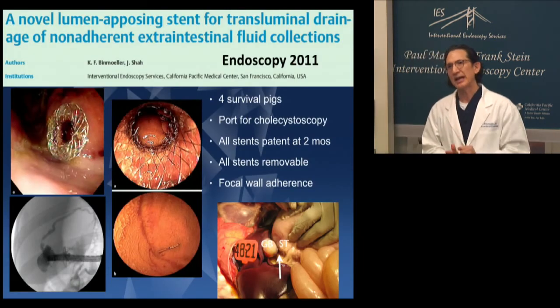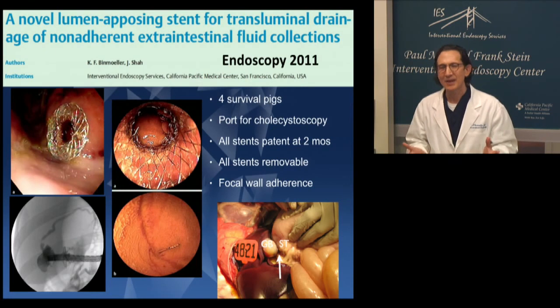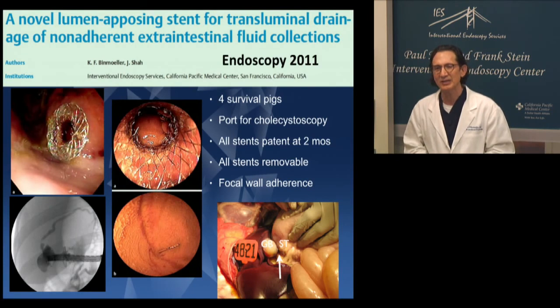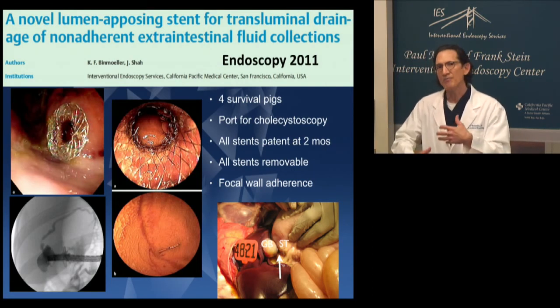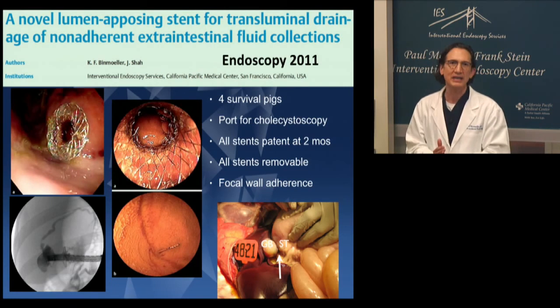So this is the animal study that I published in 2011. This animal study doesn't do justice to the many, many dozens of studies that were done that led to the final designs that we came up with, myself with a team of just great engineers. As I mentioned earlier, literally the best here on the peninsula in Silicon Valley. And I always like to take an opportunity to recognize them because they're the forgotten heroes, if you will. These engineers are just amazing, and they make this possible. So this is just for survival pigs, but it represents the culmination of many trial and error and many designs. This is just the final where we said, okay, now we're ready to publish.